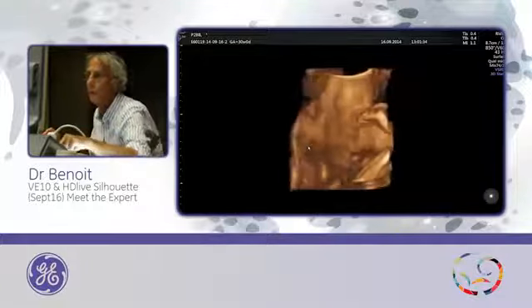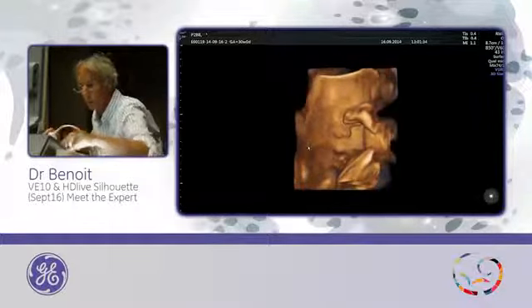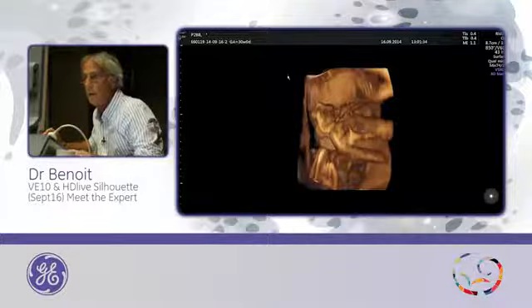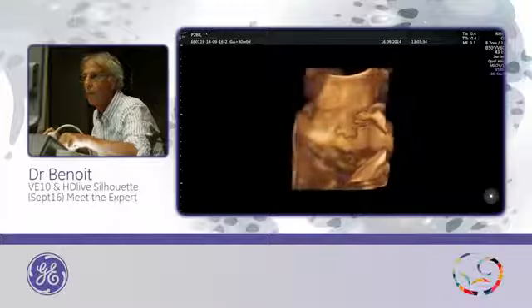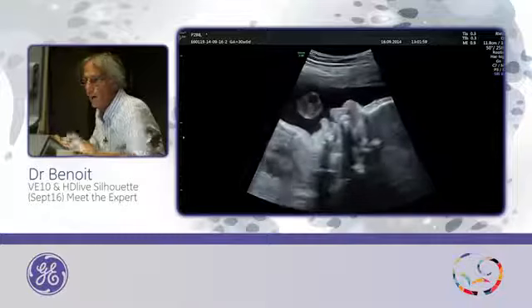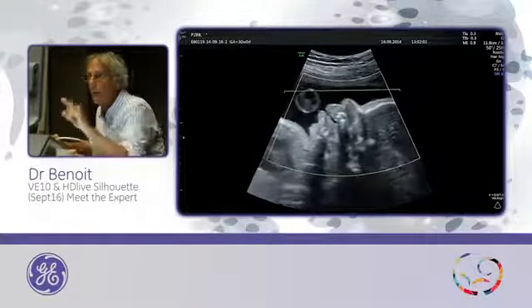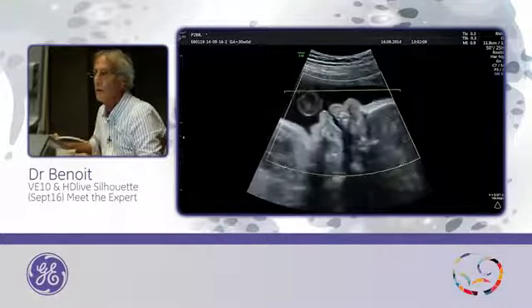And this is a part of one foot with the toes in front of the face. Yes, I will do it. First, I will use a magic cut. Okay. And there is, you can do, yeah. So yes, I will use 4D later because it's nice when the baby is moving.